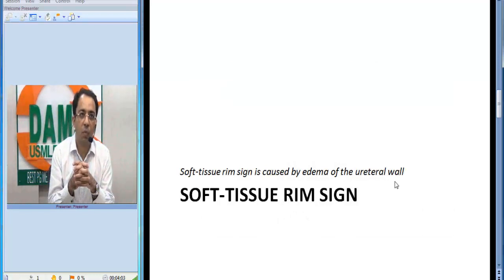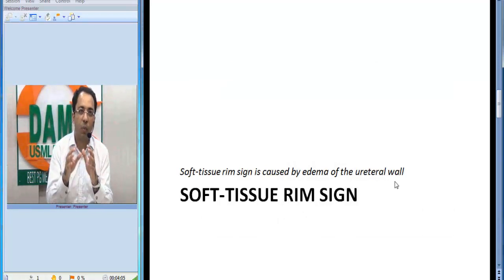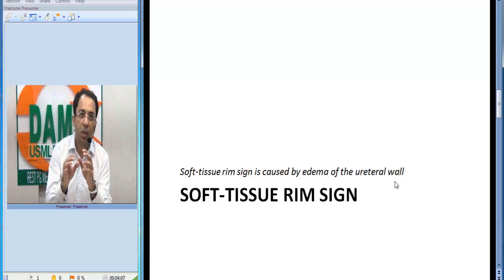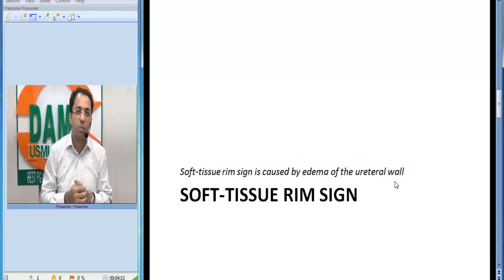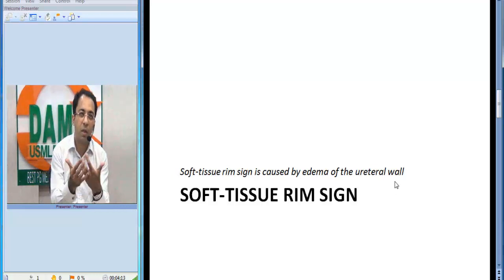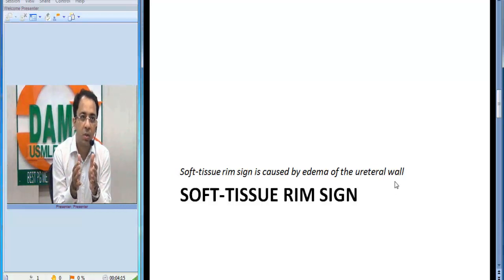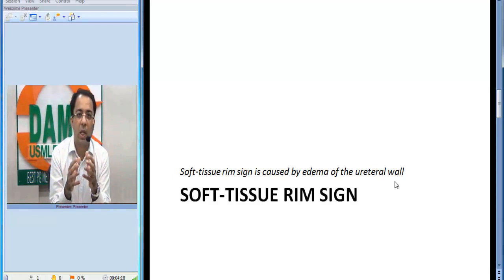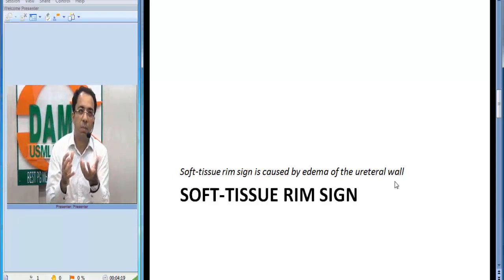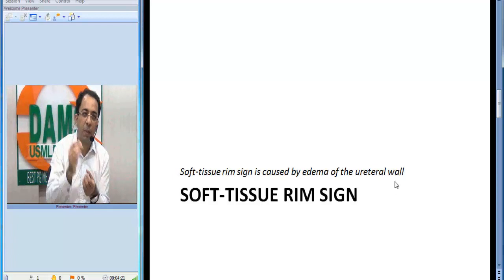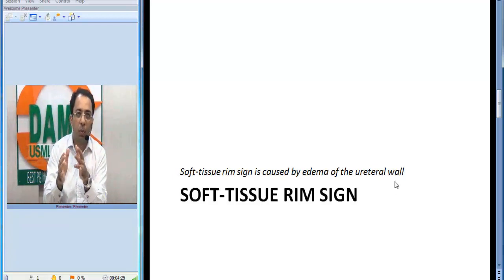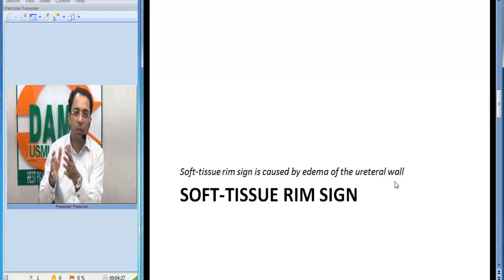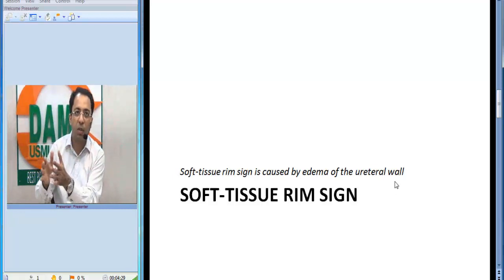The second sign is the soft tissue rim sign. Whenever somebody has a ureteric stone, the surrounding ureteric wall develops edema — that is called the soft tissue rim sign. We need it because as radiologists we have to differentiate between a ureteric stone and a phleboleth — a calcified particle in a vein. It is very unlikely that a phleboleth would have a soft tissue rim.